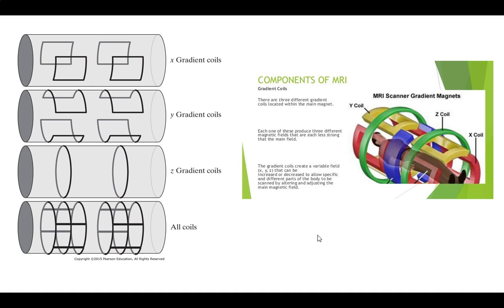Okay. So you're going to take a look at it, right? I've got the ability to set those coils by adjusting how much current I'm flowing through them. And that will set how big that slope is, which will differentiate the field. And the key trick is going to be, for instance, on selecting a slice, I'll set my Z coil to a certain amount, and I'll pick my kicking frequency, right? The RF coil. I'm just going to call it kicking, just so you think of those terms.